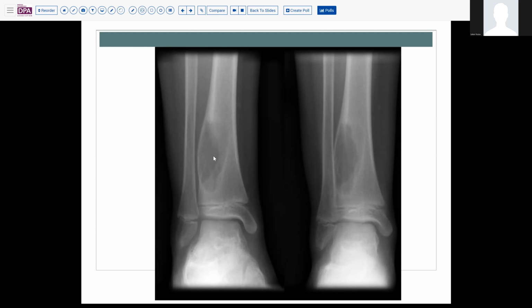And it has a variety of pairing partners that it can have as well. Also, in this differential, if we're thinking about giant cell tumor, there is an immunohistochemical stain that can be available in some locations. We don't have it in our lab yet, called H3G34W, that can also be used to differentiate giant cell tumor.